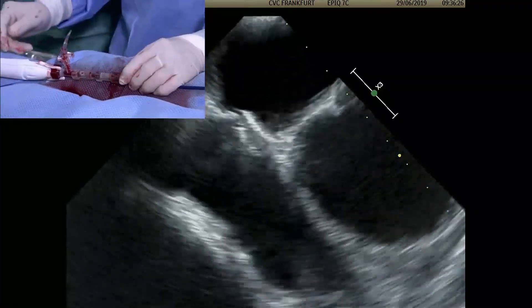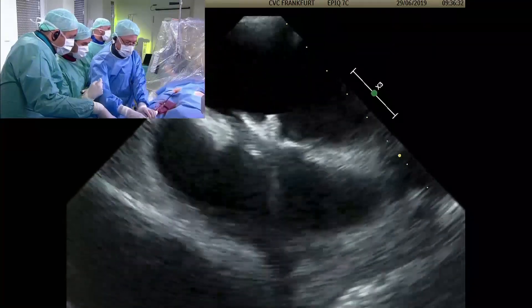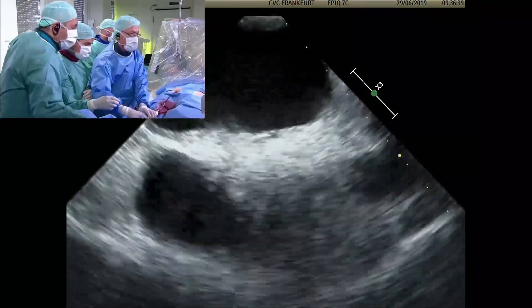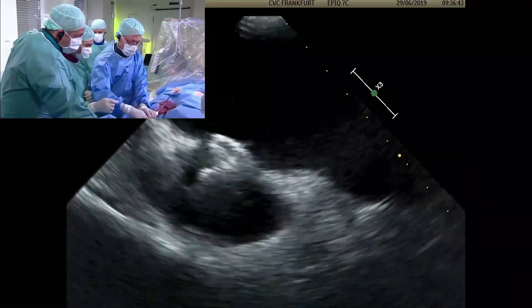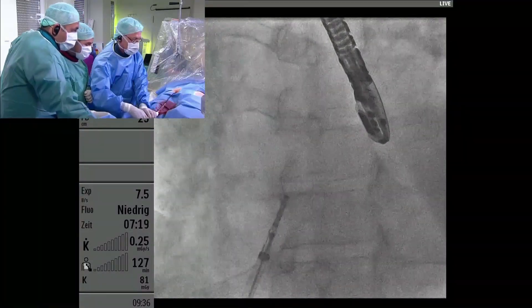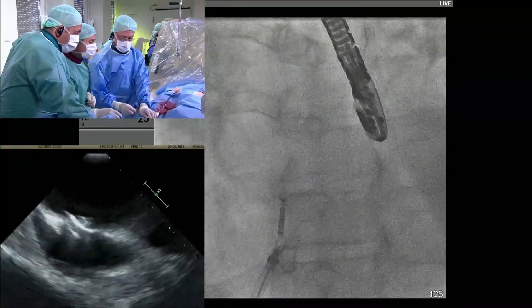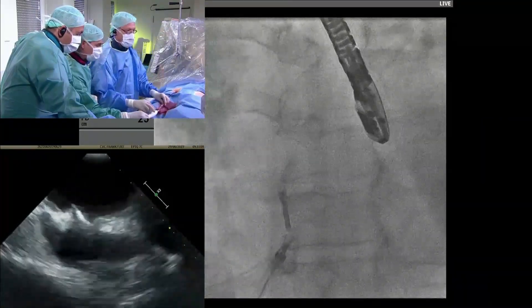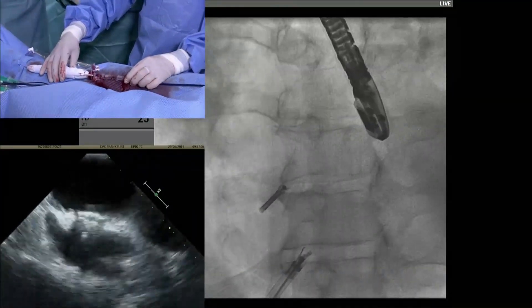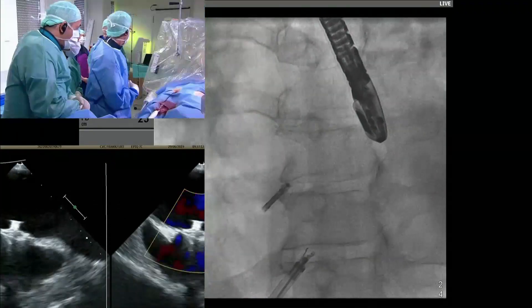To me that looks good, that looks perfect. We need to release tension - I'll advance a little bit more. It's just tilted because of the sheath, but it's nicely in. I think we can release it. In order to release it, I press this one here in the direction where the arrow is. There's a marker moving which tells me I have to rotate much more. Now it's at hard stop and now it's released. You can see it tilting now. Echo looks fine. Fluoro looks fine. That's it.